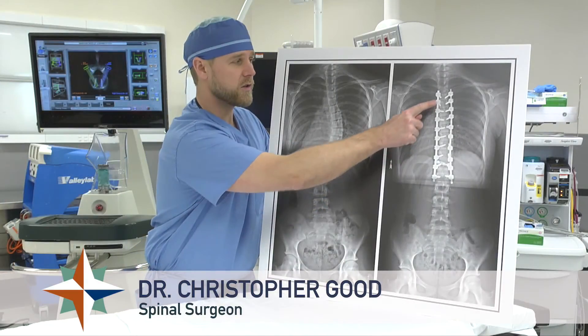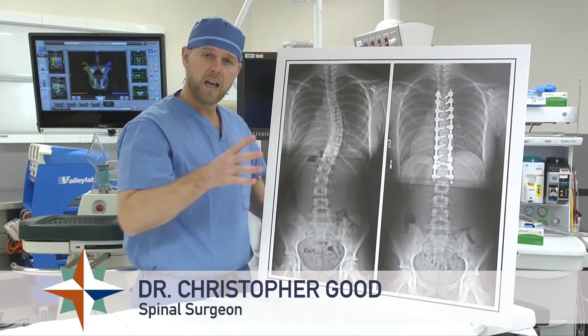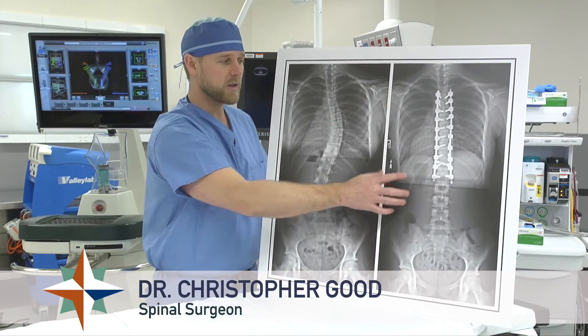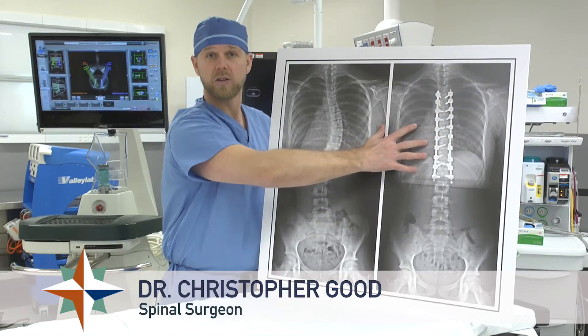We can see that with the surgery, metal implants are used to fix onto the spine. During surgery, we actually straighten and de-rotate the spine. This not only straightens and fixes the scoliosis, but it actually rotates and fixes the ribs and the lungs.